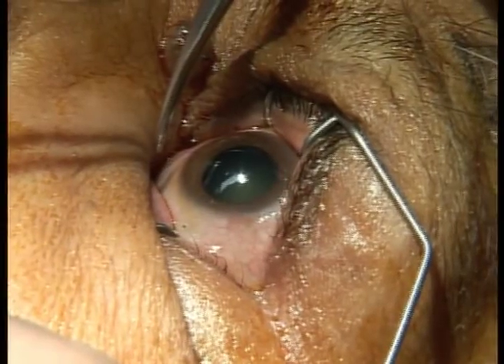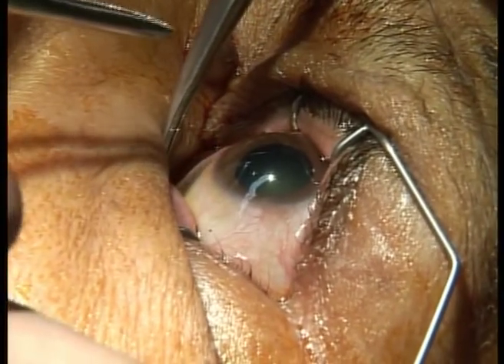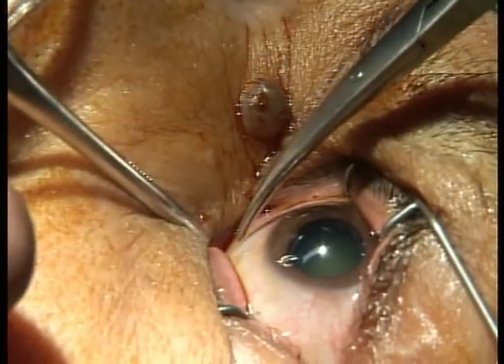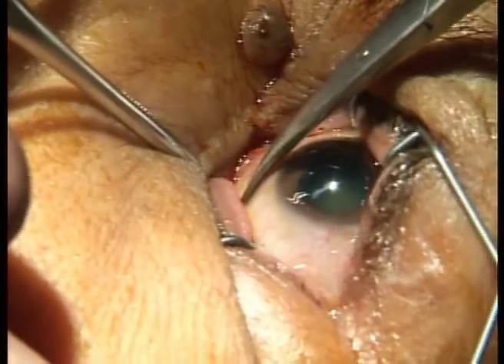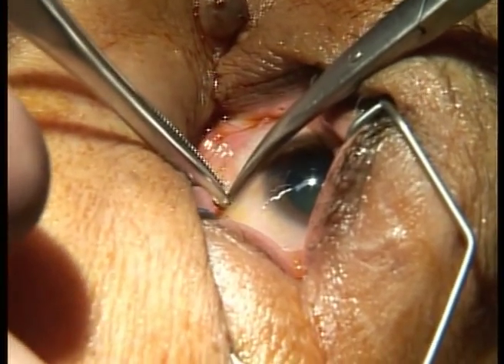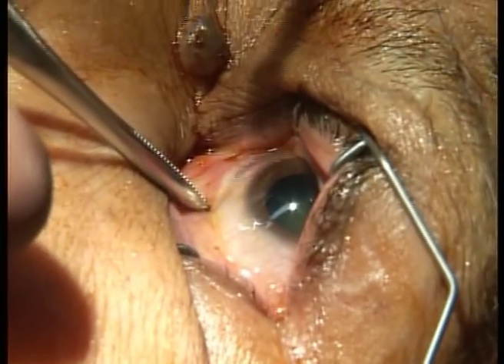Could I get you to look up over your head, and look across towards me a little bit. Look across to me. That's better. So here I don't have fabulous patient cooperation, so sometimes I can just pull the globe with my closed scissors away from the eyelid and then pick up like that.